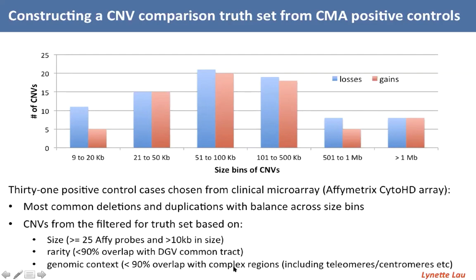So that's kind of in this last point here. We excluded a lot of the regions that are overlapping some of these complex regions, including telomeric and centromeres.